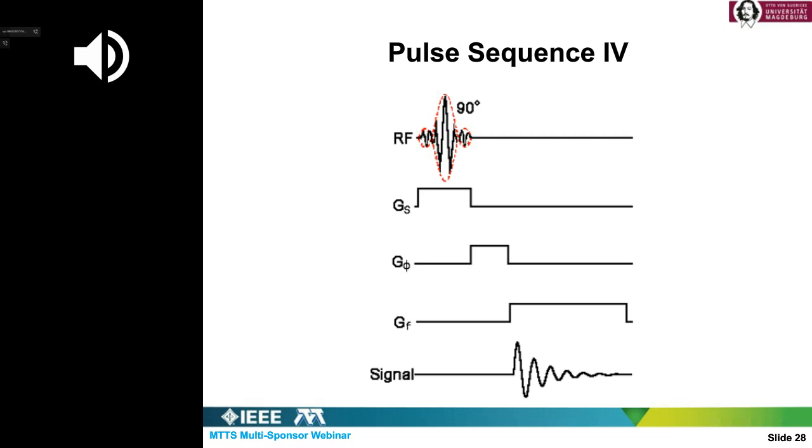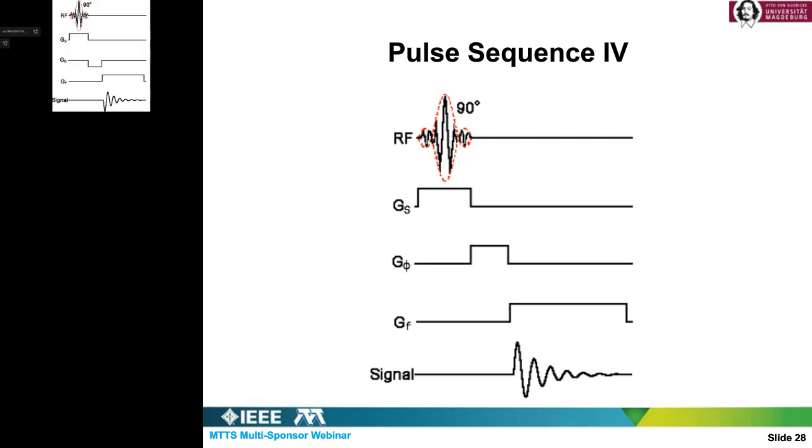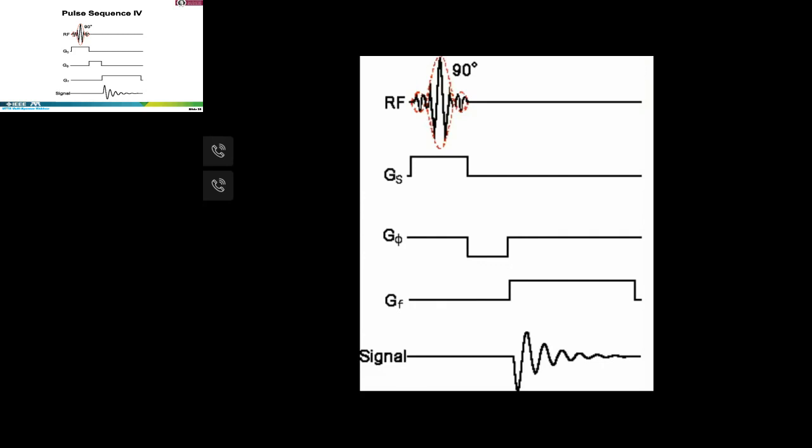This is here another animation. The first line is the pulse resulting in flipping the spins.